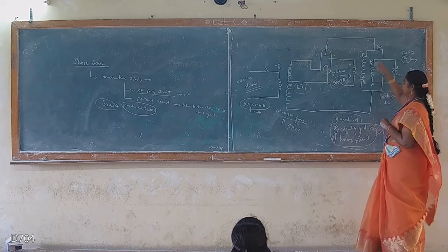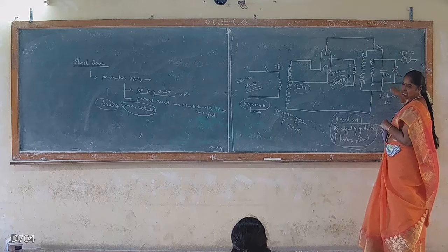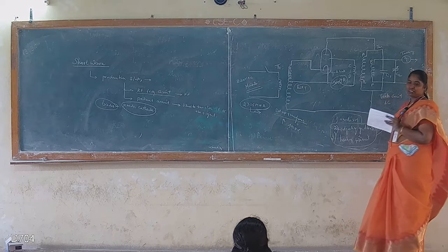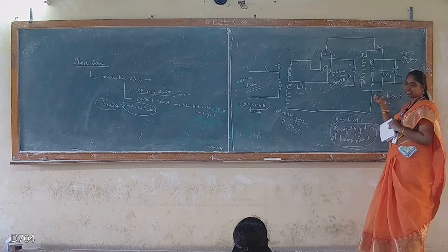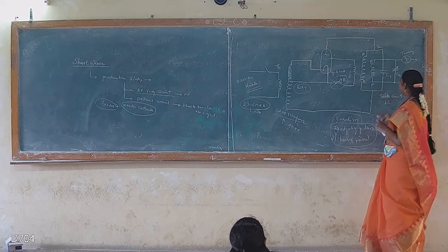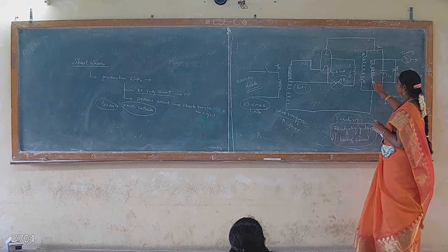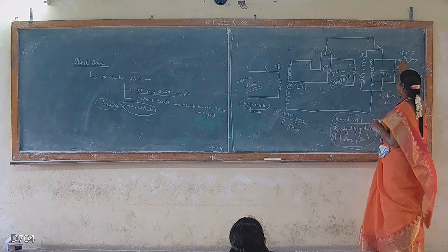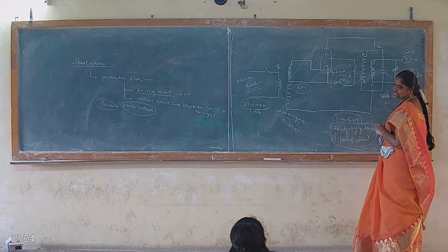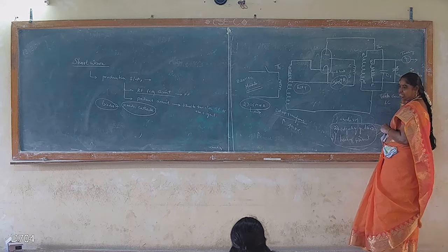Now, based on the voltage, the current here is produced by the triode valve, so the high frequency current can be produced. This high frequency current produced by this circuit has to be transferred to the subject. In order to transfer it to the subject, there is another circuit: a coil EF with capacitor C2. So this is again another form of tank circuit.